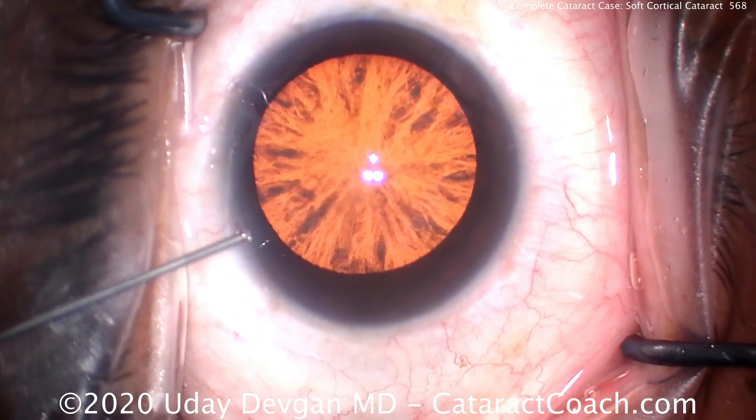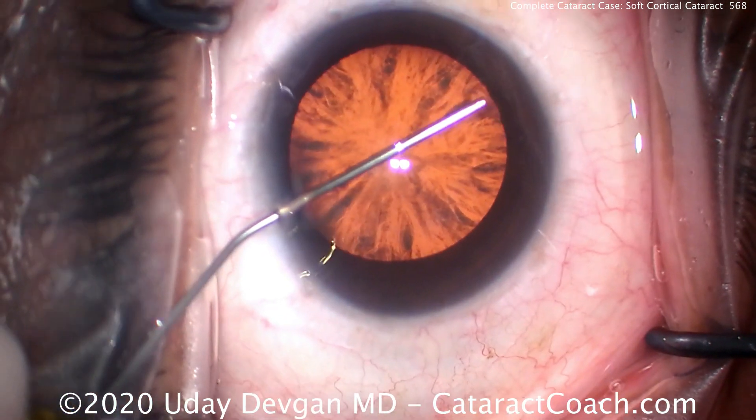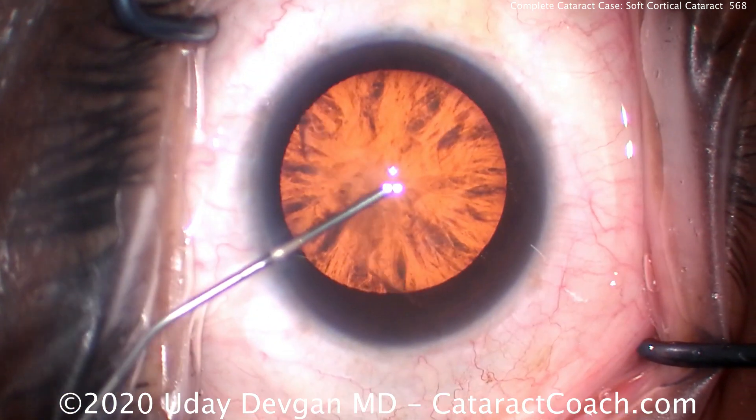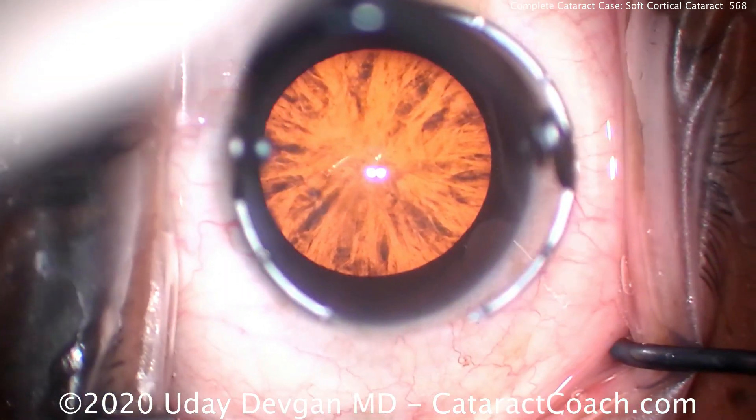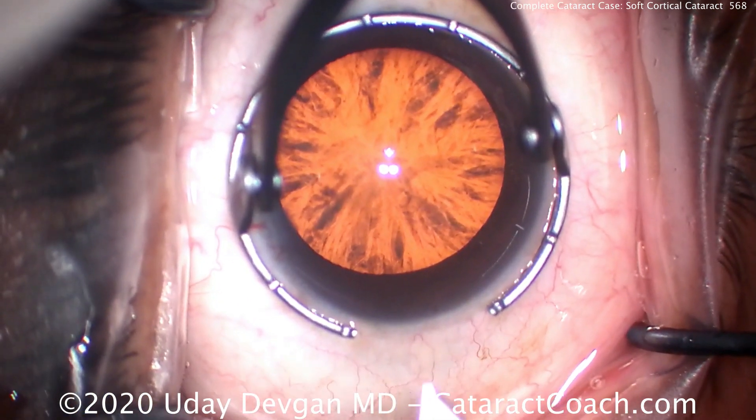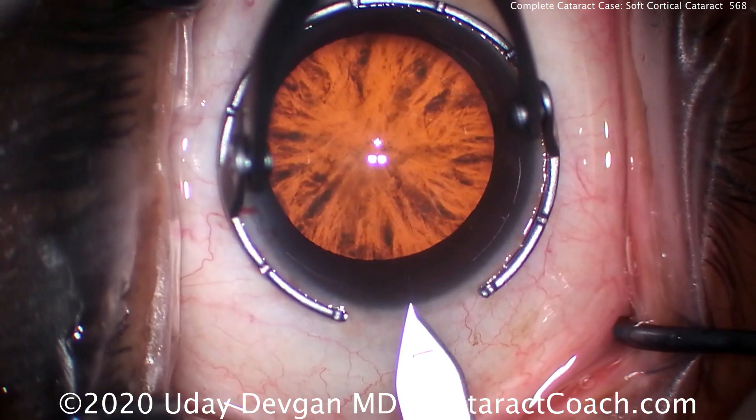If you look carefully at his eyelashes under the plastic drapes, they're very dark — this is not an old patient. This patient is relatively young, and most patients with soft cortical cataracts are on the young side. This patient is only 50 years old.